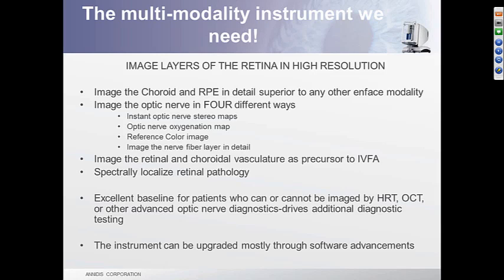Really it is even a precursor to fluorescein, and in some cases an adjunct or replacement. And certainly this is an option for patients who we can't image through OCT, HRT, or some other testing modalities because of the near-infrared application.